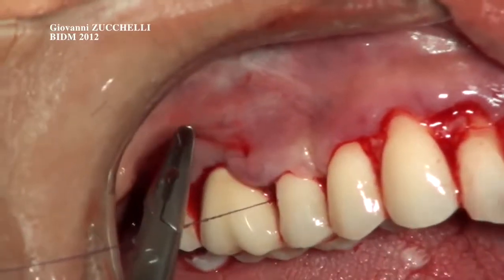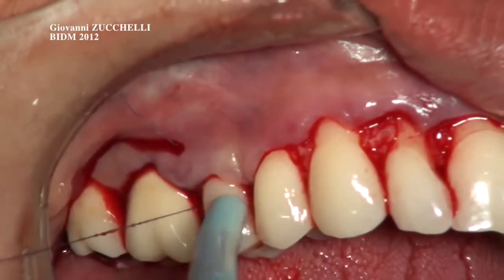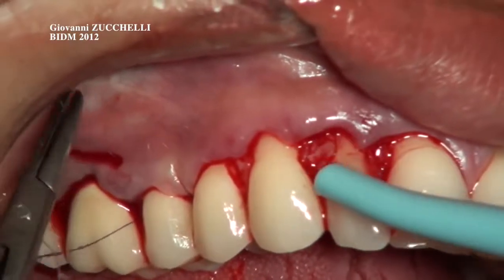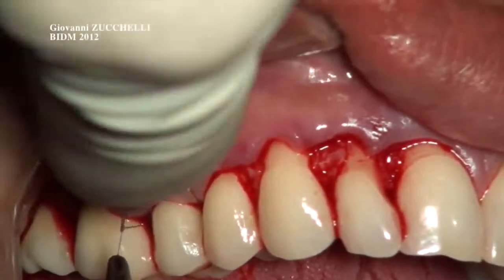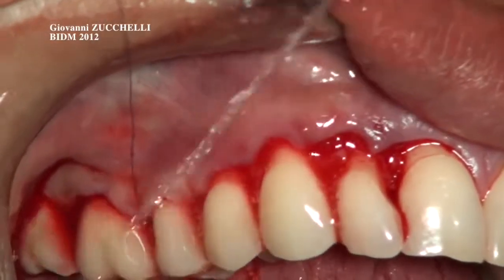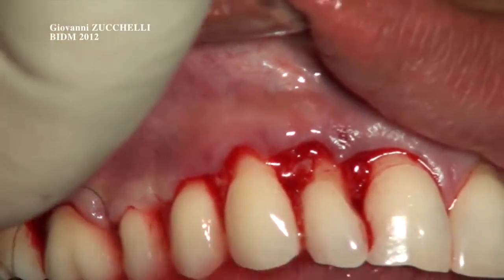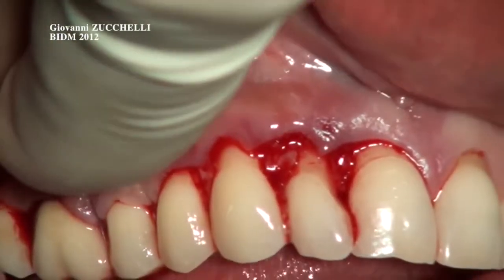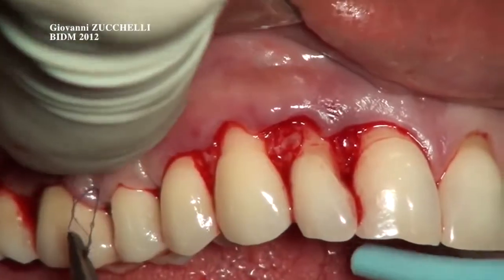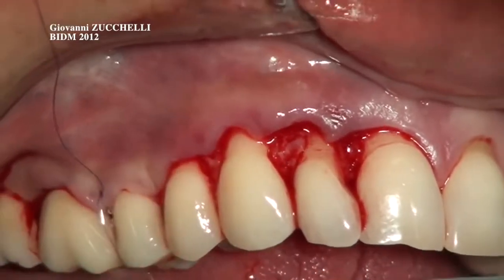Please look at this. I have to check that the surgical papilla fills and fits completely the interdental space, and this is the time to close the knot above the surgical papilla in order to completely cover the mesial root of the molar. You can see that the mesial root of the molar together with the premolar are completely covered by my coronally advanced flap, and both the surgical papillae fit the anatomic papillae.